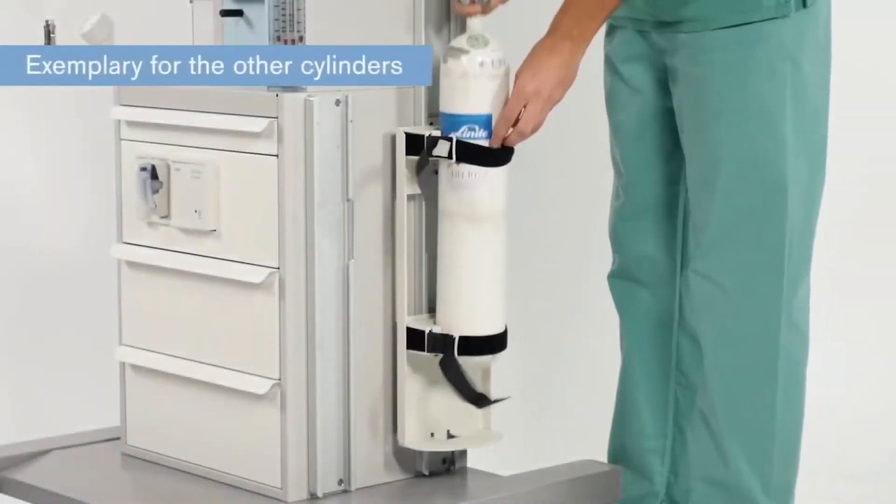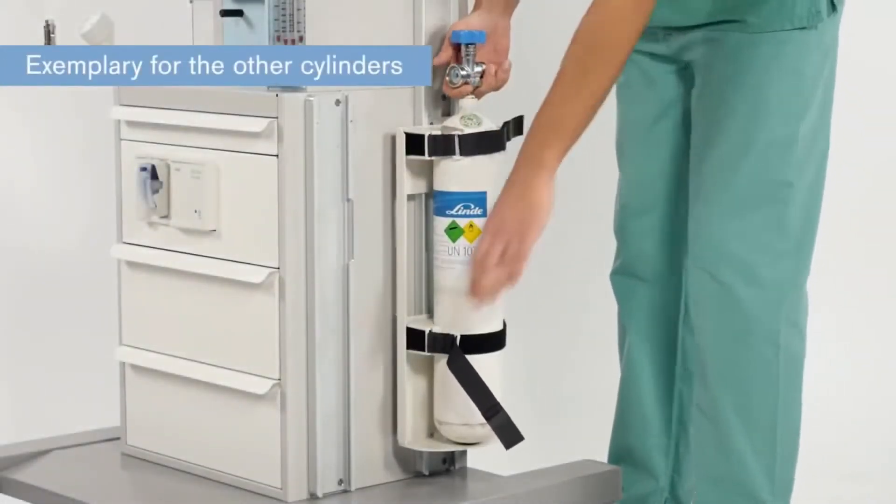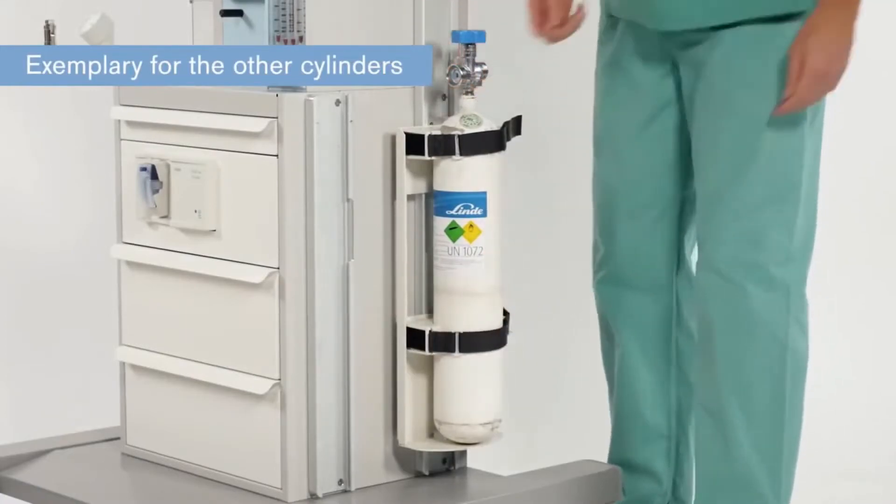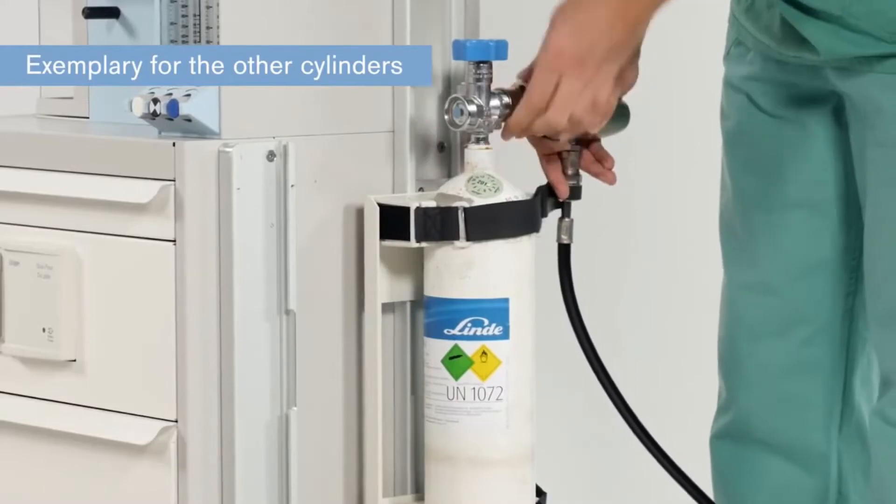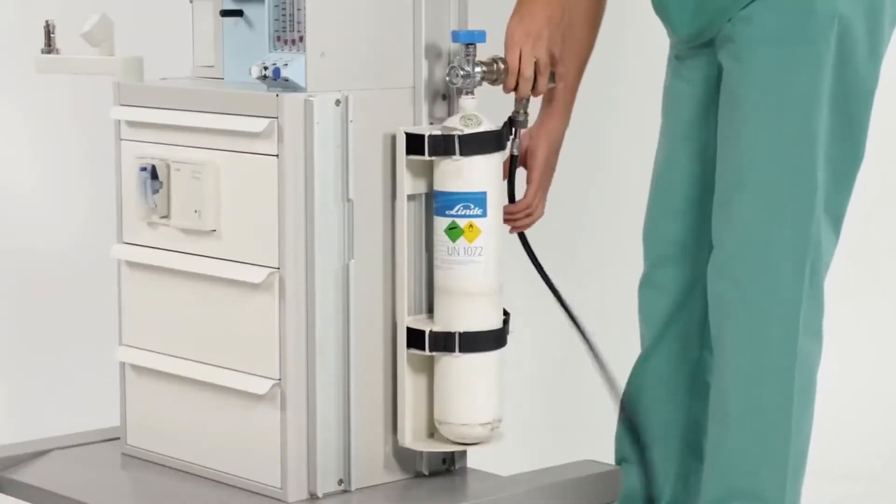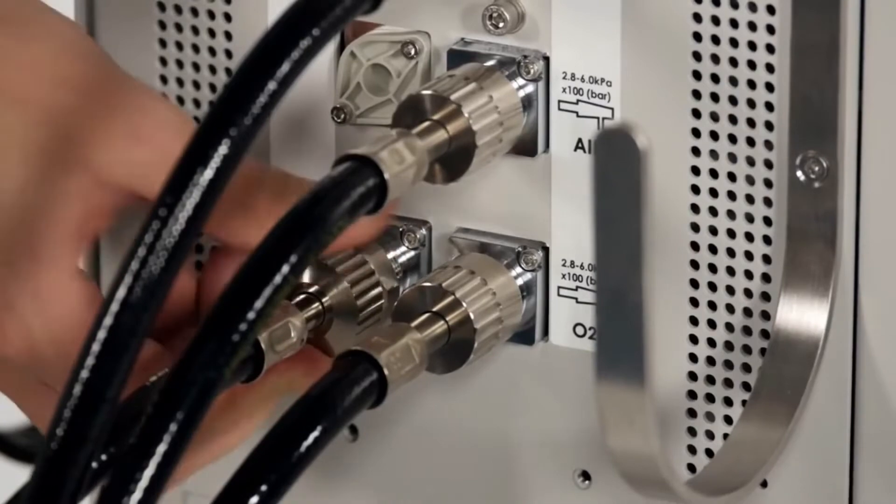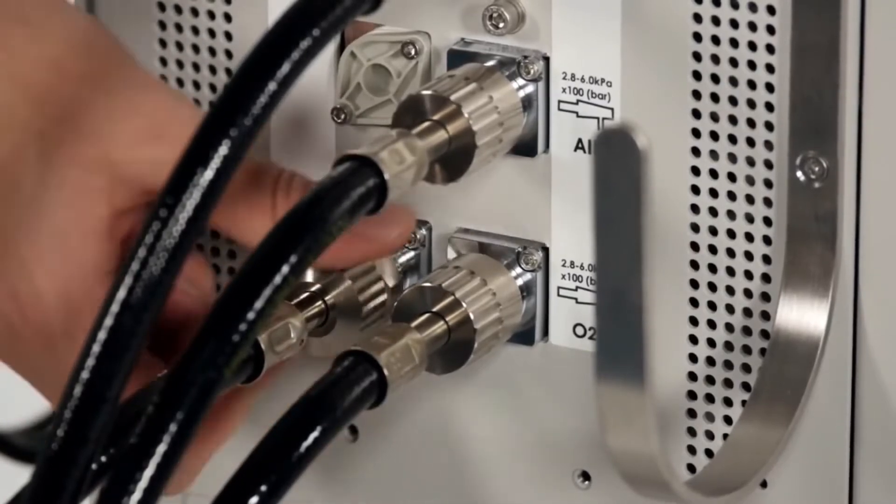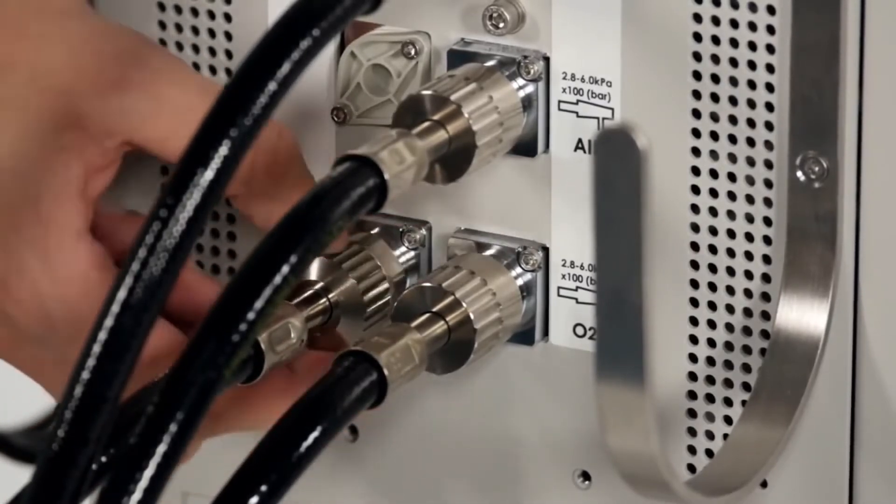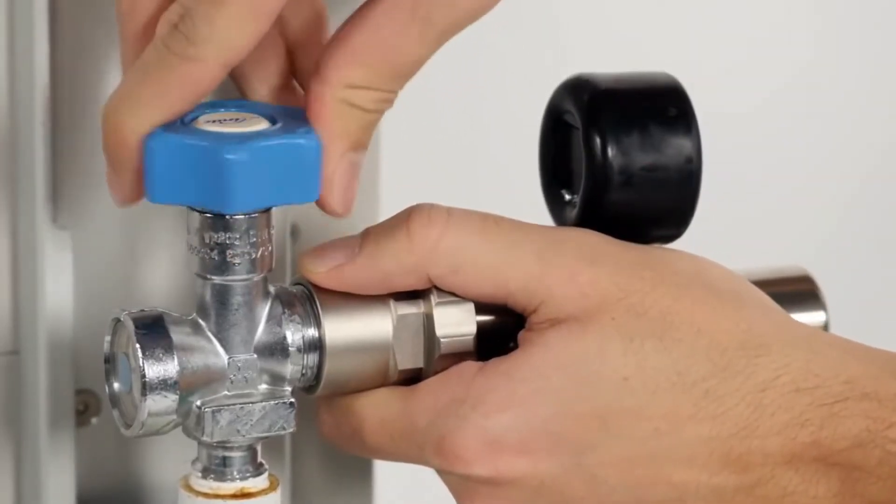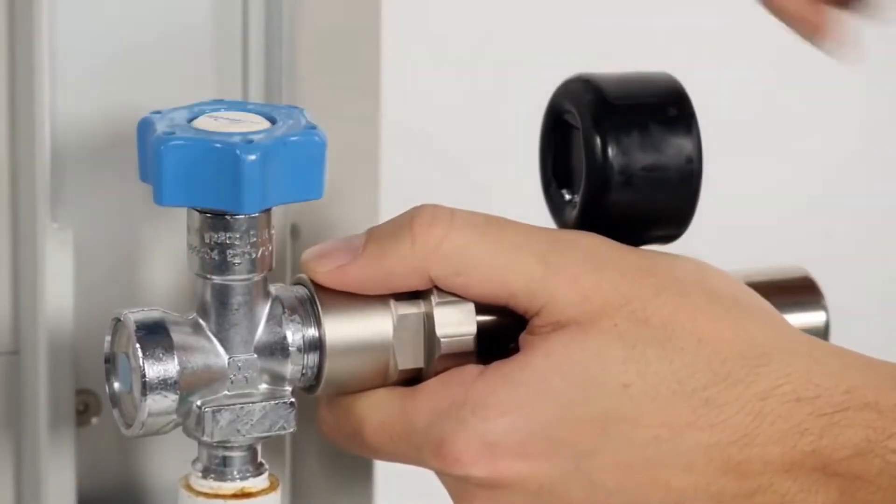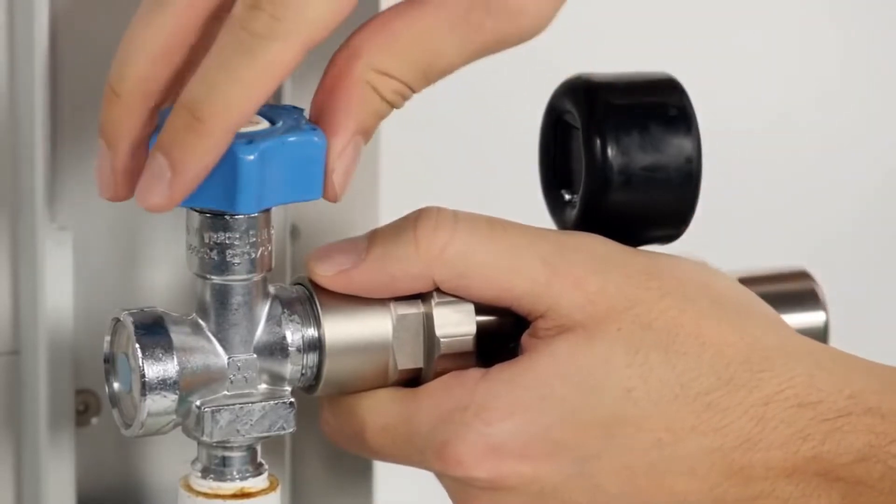Place the full cylinder in the cylinder holder and secure it in position. Screw the pressure regulator onto the cylinder valve. Screw the compressed gas hose to the pressure regulator and to the connection of the gas inlet block. Open the cylinder valve and check the pressure on the pressure reducer. Close the cylinder valve.